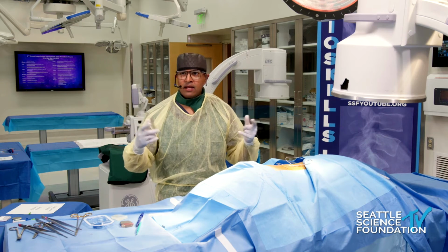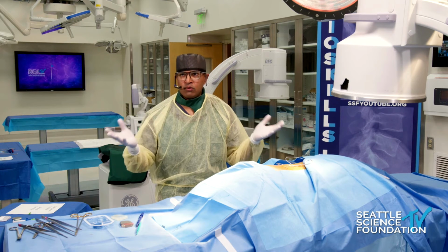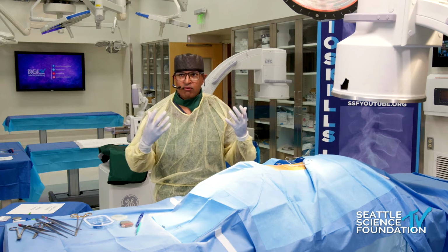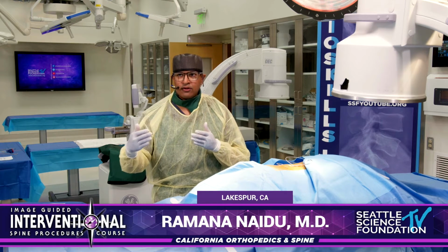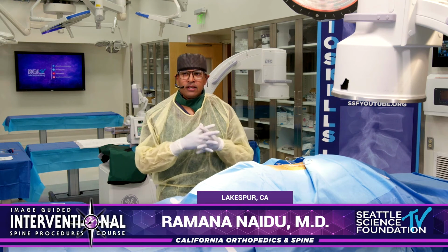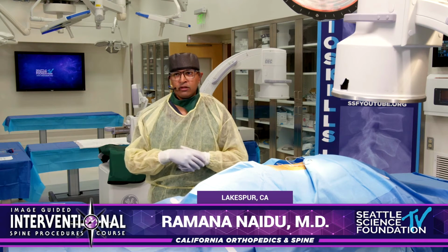Again, if we abuse that, there's no question CMS is going to jump on that and say, hey, let's retract coverage or reduce reimbursement. So it's a very important code to use. It's something to build into your practice because, again, there's a precedent already in cardiology with doing that. Let's just be mindful and purposeful in how we use it so that we really can apply it the way we want to, which is to make the therapy better for our patient. And that's really the bottom line. So great commentary on the fact that there's a CPT code for this, and to be careful with that code, similar to our colleagues in cardiology for remote monitoring.